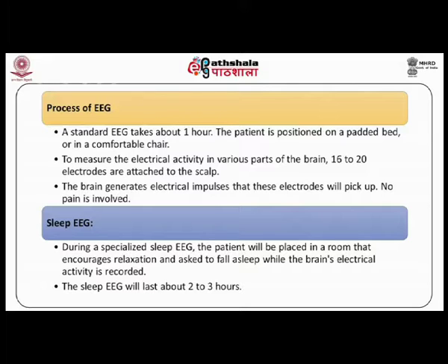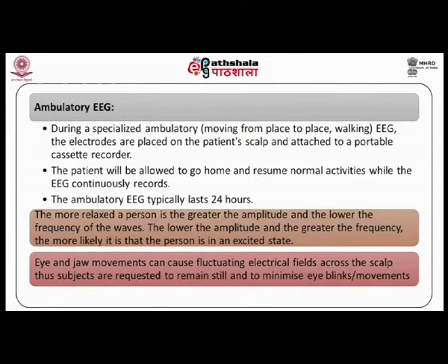Sleep EEG. During a specialized sleep EEG, the patient will be placed in a room that encourages relaxation and asked to fall asleep while the brain's electrical activity is recorded. The sleep EEG will last about 2 to 3 hours.